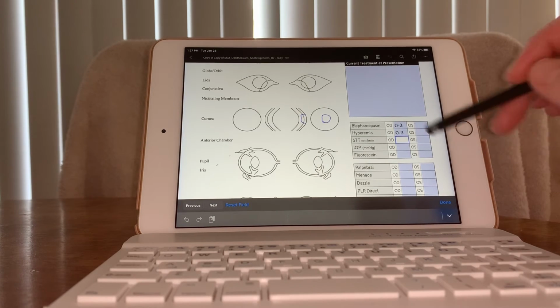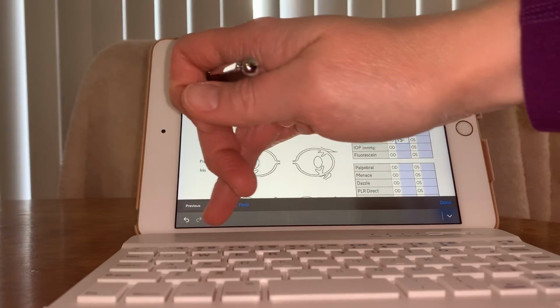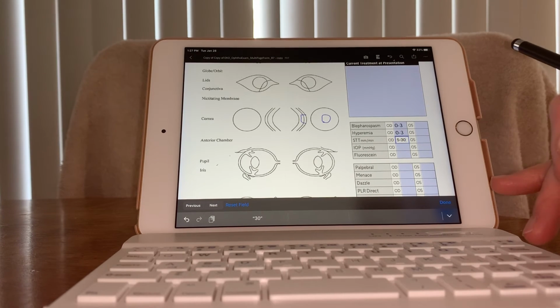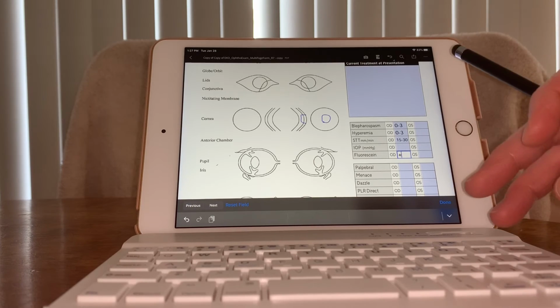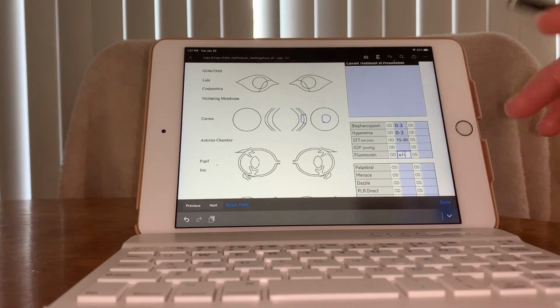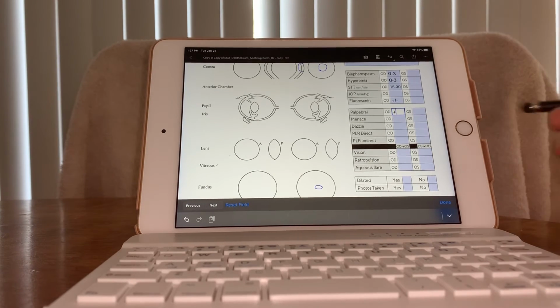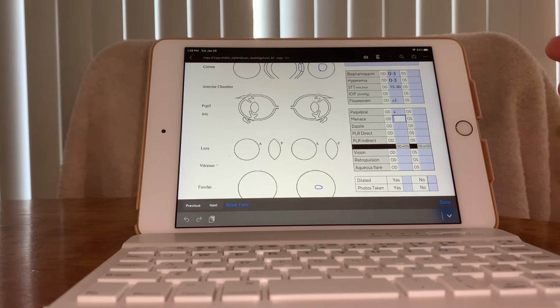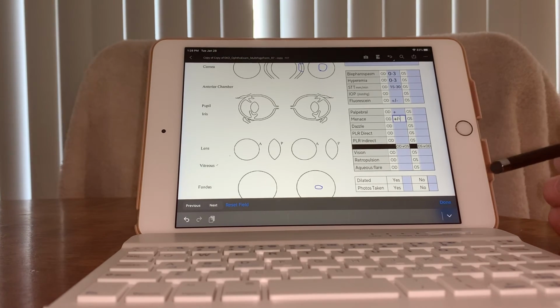This is a Schirmer tear test value in millimeters per minute. In a dog, normal is going to be between 15 to 30, pardon me. Intraocular pressures, again, would go in here in millimeters of mercury, and fluorescein would be shown as either a positive or a negative value. Palpebral reflexes are either present or not, so positive or negative. Similarly, the menace can be positive or negative. However, you can have a decreased menace, and I would typically represent that by a plus minus like that.